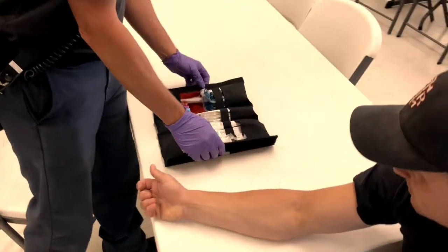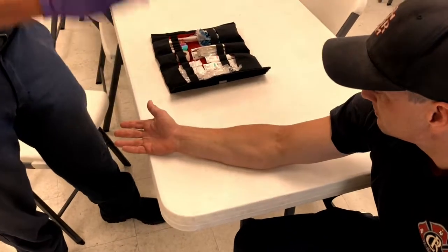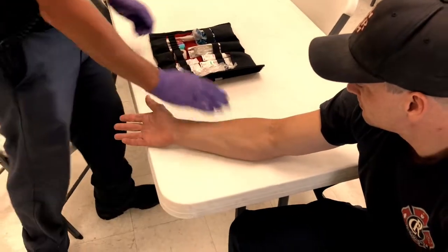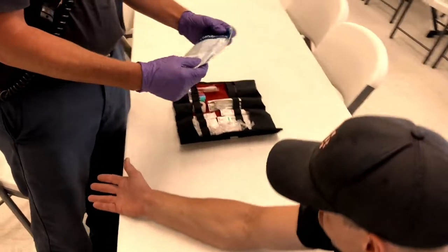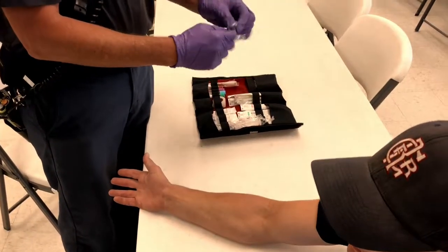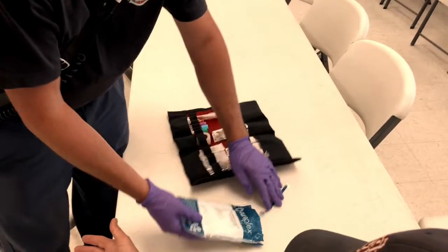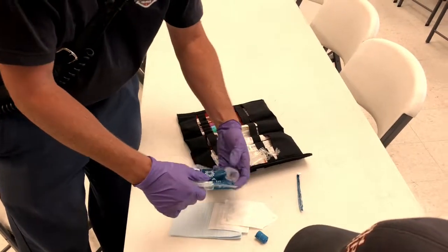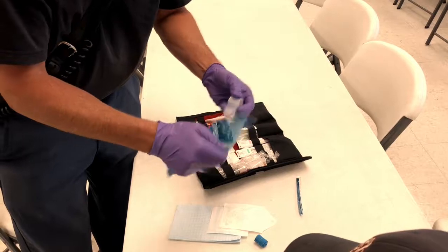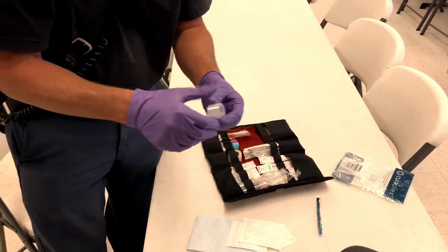Okay. Just like we talked about before, we're going to work on our good setup before we start any IV. So we have identified our patient, we've identified a good arm for this patient. Nice, healthy patient, good arm, lots of good IVs. Get our start bag set up, sprawl it out, and make sure it has everything we need in there, including tape, which has already been pre-set up for us.